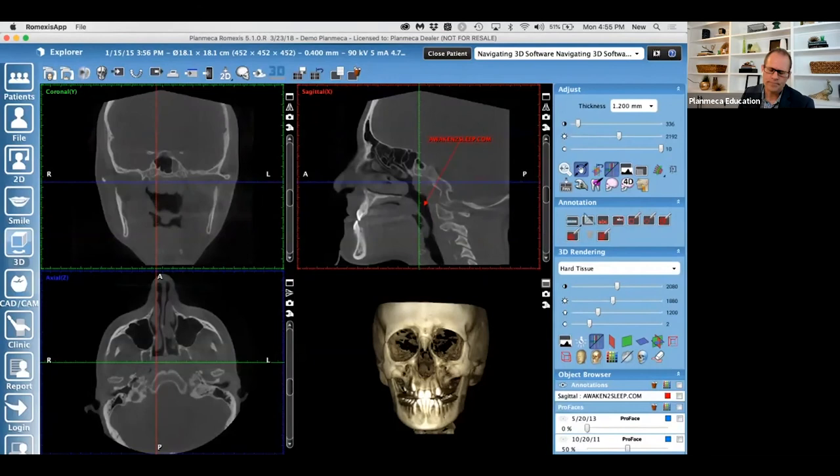A go-to image, Jody, let's say you're doing a 10 by 10 or an 11 deep airway, 8 high. You're asking me without grabbing my numbers off the top of my head, probably 35 microsieverts at normal resolution. I can take an image of everyone's teeth in their mouth at low resolution for about 12 microsieverts. We can take 3D PAs at 3 microsieverts. A PA in the mouth is 10 microsieverts, unless you have a long cone, short rectangle collimator, which most offices don't. They're firing about 10 microsieverts. So a 3D PA is taken at about 3 microsieverts.